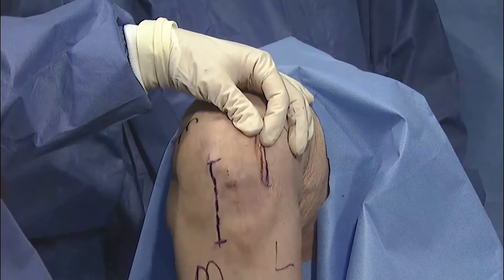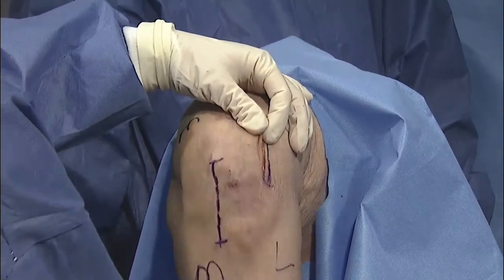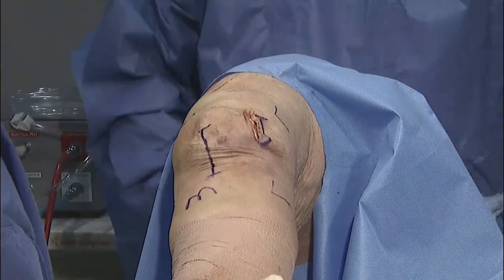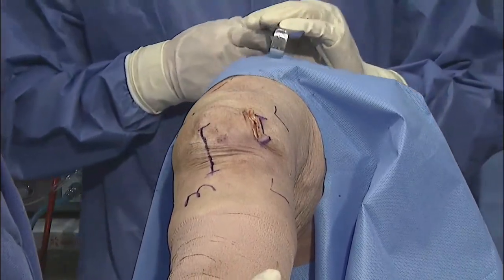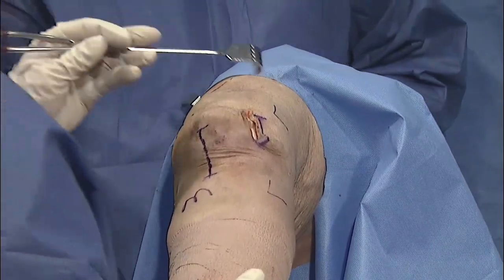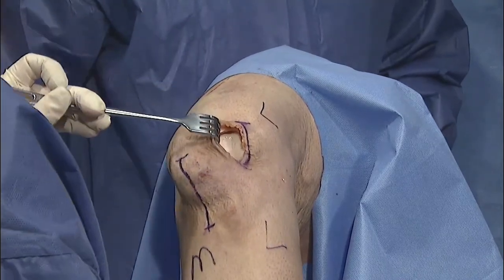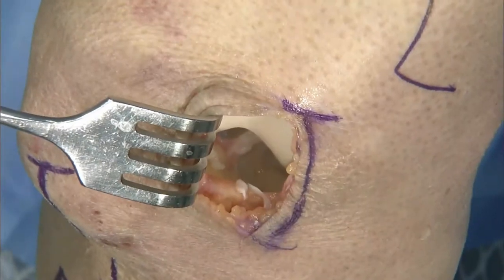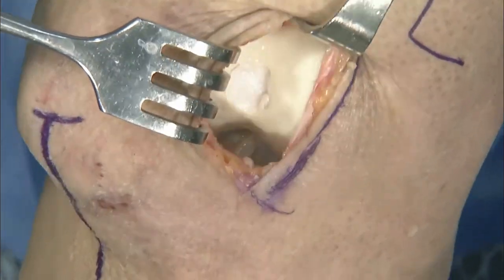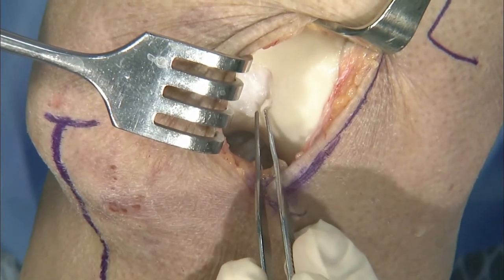Do you put any fibrin on top? Yeah, you certainly can. And this one, we had pretty good coverage inside the defect. So actually, if there's a pretty good defect, you don't necessarily need to, which I'm going to do here. I just want to show, hopefully, the stability of the defect because it's pretty impressive. So if we go back into the knee and then grab that, yep, right there. So this little thing that you're seeing right here is just a piece of cartilage that came up on top.